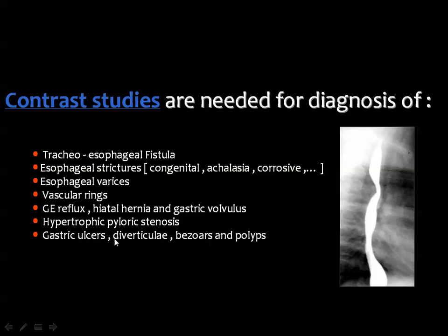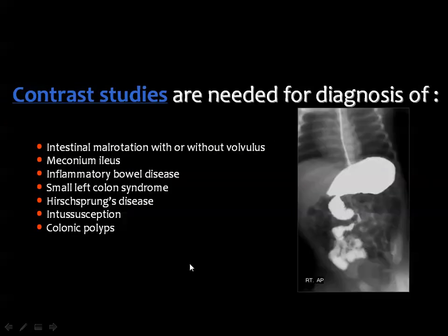Also in the diagnosis of gastroesophageal reflux, hiatus hernia, gastric volvulus, hypertrophic pyloric stenosis, gastric ulceration, diverticula, gastric bezoars, and polyps.